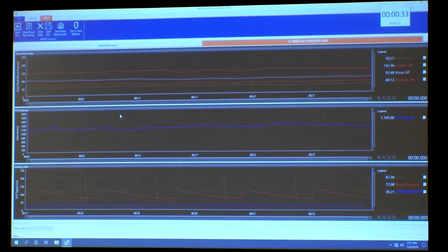We would collect a three-minute baseline. During that time we would be instructing the patient, so I'll go ahead and do that.